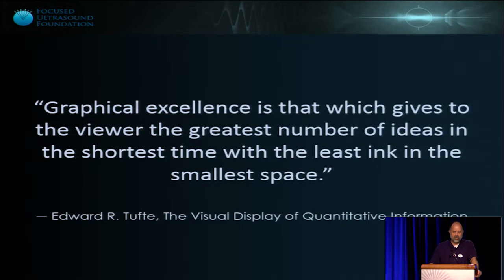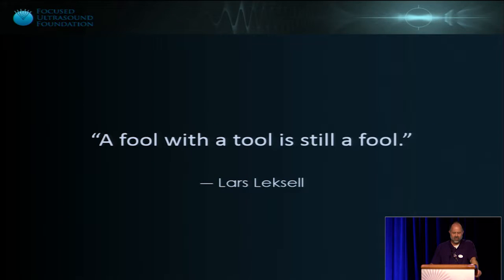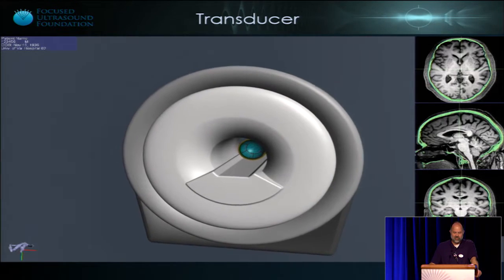Edward Tufte speaks for himself, but again, showing is better than telling, and the richer and more compact that showing is, the better. But we're also warned by Lars Leksell, and I think also Grady Booch, that no matter how pretty our pixels are, it's no substitute for clear thinking. So here's what this looks like.